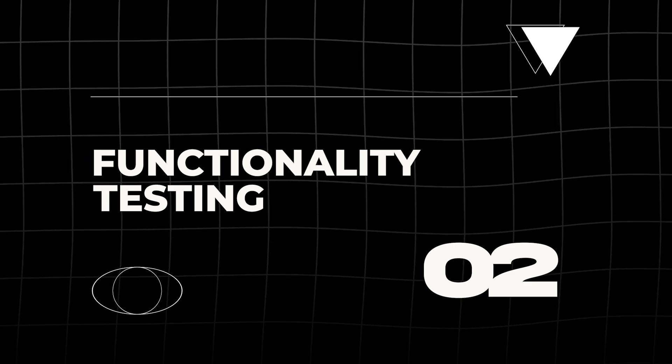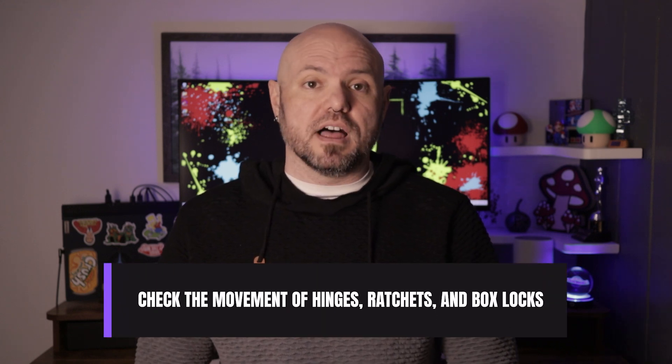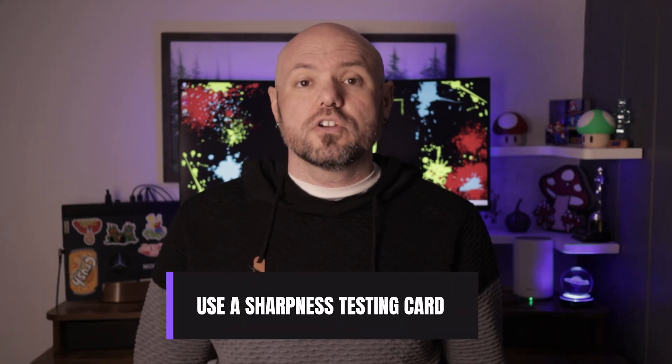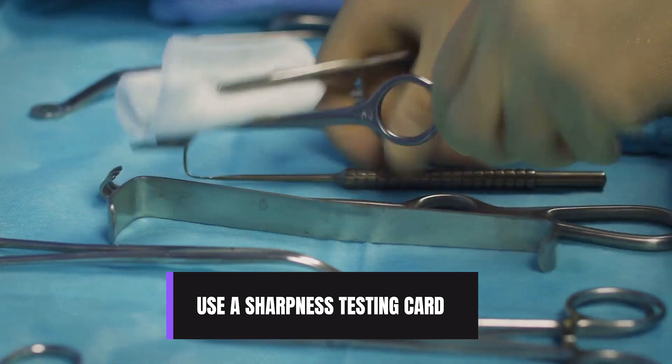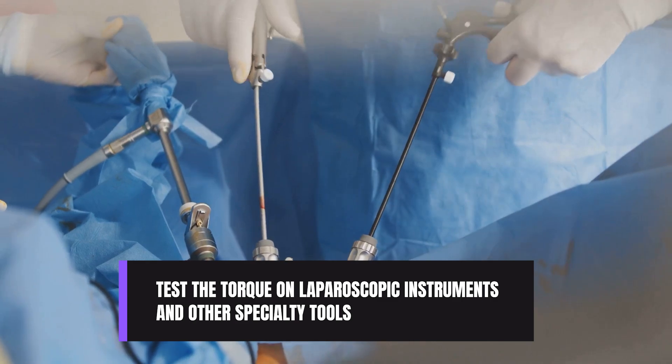Next is functionality testing. Instruments need to work perfectly to ensure a smooth surgical procedure. Check the movement of hinges, ratchets, and box locks — they should open and close smoothly without sticking. Use a sharpness testing card or dowel rod to confirm scissors, chisels, and other cutting instruments are sharp as expected. Test the torque on laparoscopic instruments and other specialty tools using appropriate testing devices.